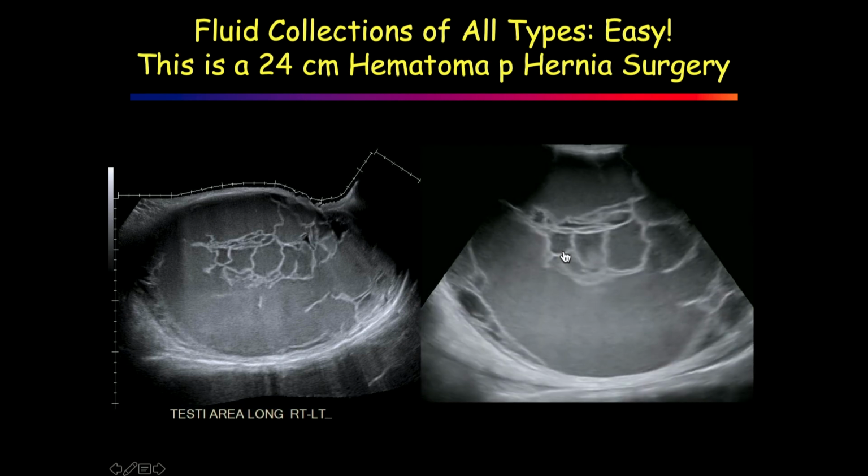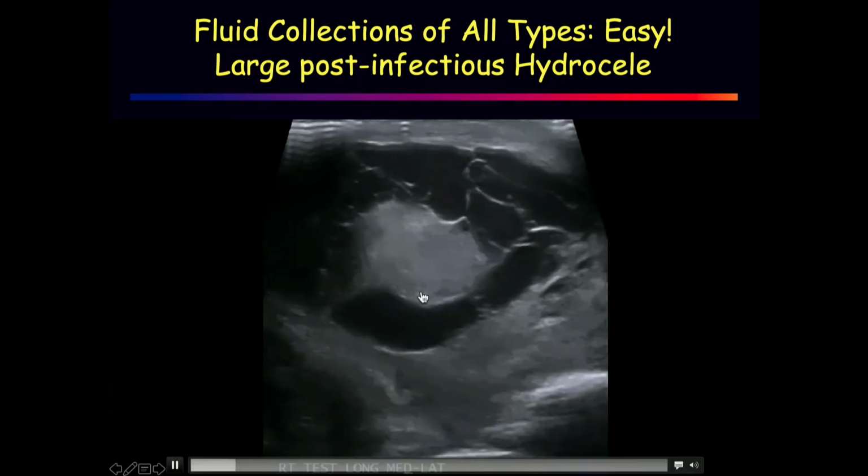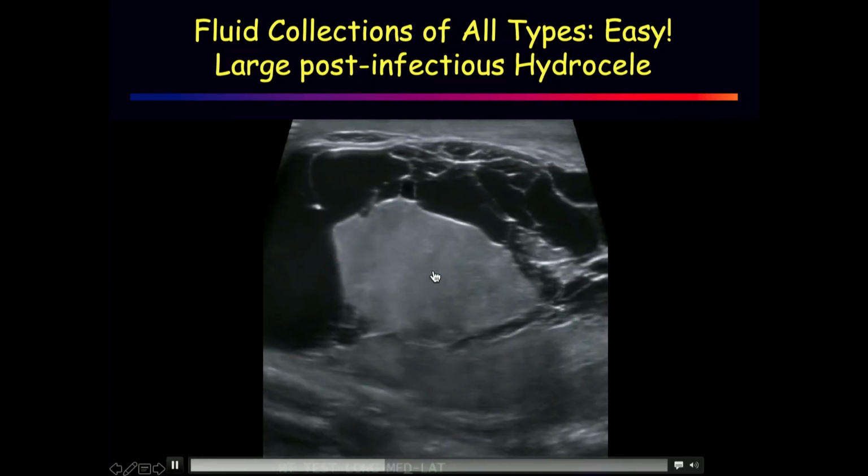Fluid collections we're really good at picking up. We generally have a history. This was a hematoma after hernia surgery. This is a post-infectious hydrocele there.